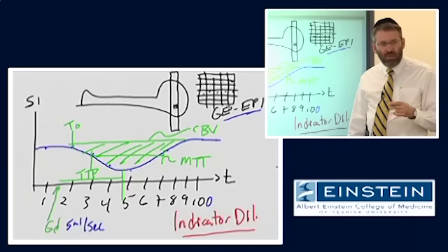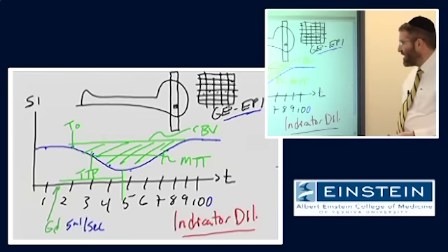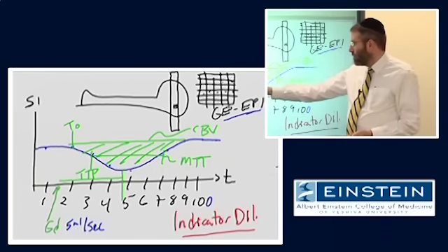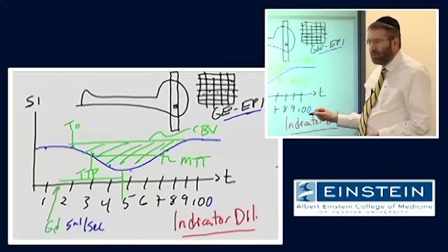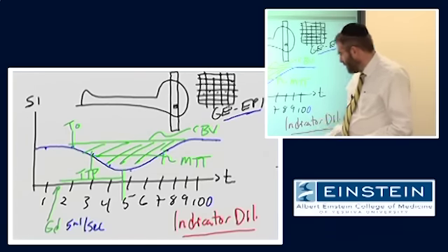They still do that? Sound familiar? The nurses usually do it, so maybe you guys didn't actually have to do it. You're just injecting some contrast agent, something to measure how it affects your signal later on. And it can give you all of this hemodynamic information. Okay?